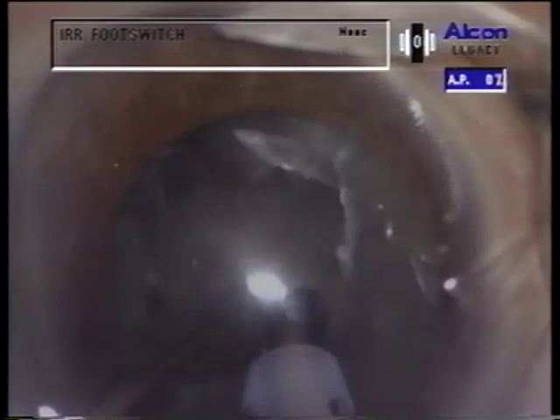If you notice in that first case, it was a little more dense lens. Right here I'm taking segments as they come. There's the first segment we fractured that I had left in place. Now we just have the upper hemisection — we can slide it in, attack it from the top, and break away a piece just by pushing down with the spatula. On aspiration only, maybe you can hear the pump speed — that's my indicator of what foot position I'm in. Because sometimes you can't hear the buzz of the ultrasound on the very low early travel of the foot switch on position three.